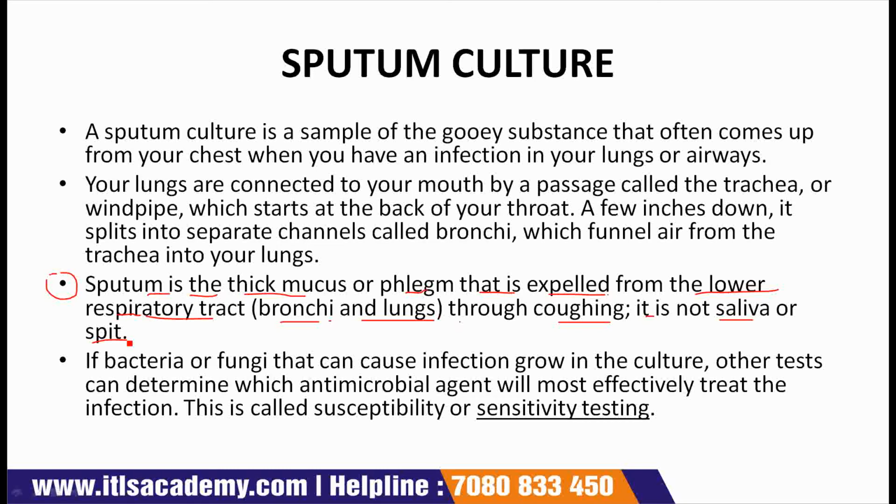Care must be taken in the sample collection process to ensure that the sample is from the lower airways and not from the upper respiratory tract. Sputum samples may be expectorated or induced.